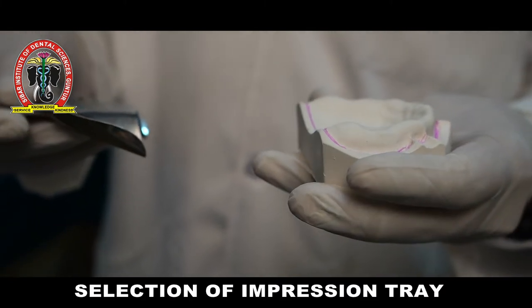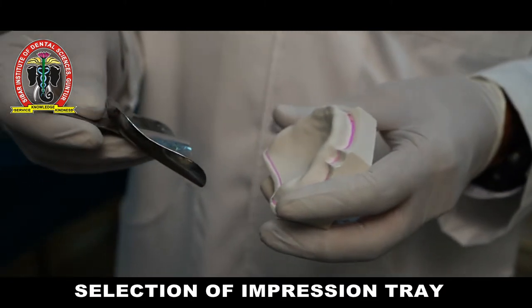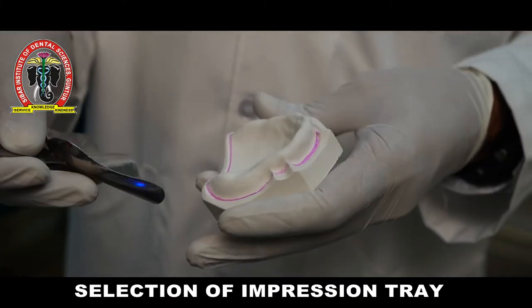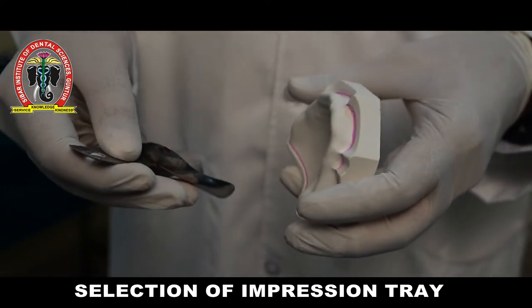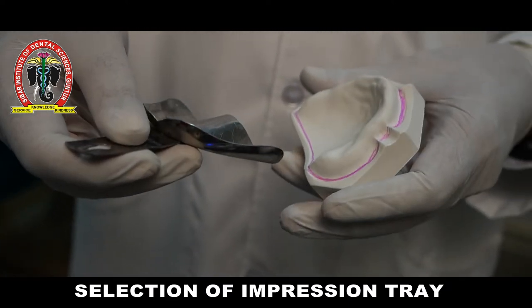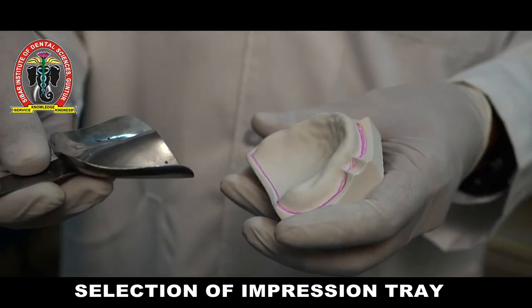Preliminary impression making in a completely edentulous patient. The first step is arranging the required things for the procedure, and next is the selection of the tray.